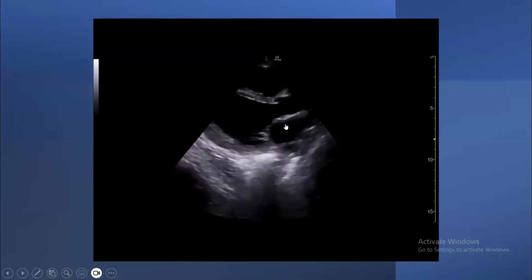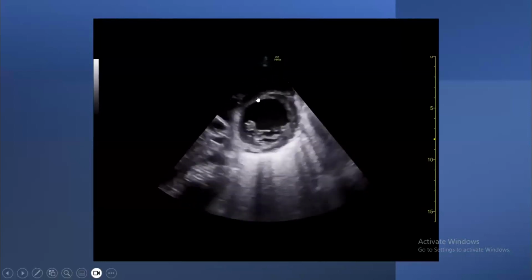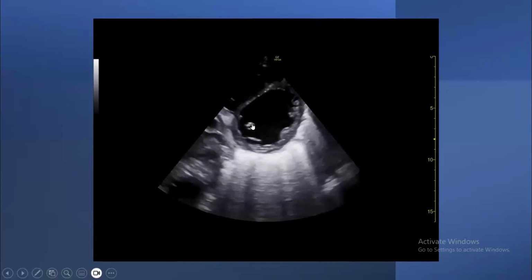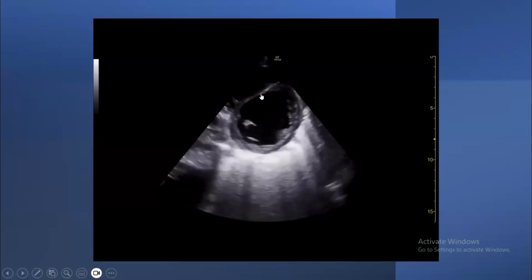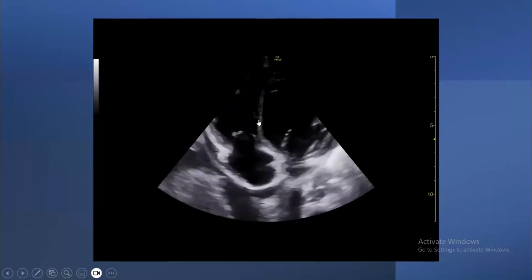This patient is tachycardic. And dilatation, as you can see, dilatation and D sign, it is the right ventricle and the D sign, and the right ventricle is almost not contracting, right? It's almost like just moving, right? This is very poor contractility.